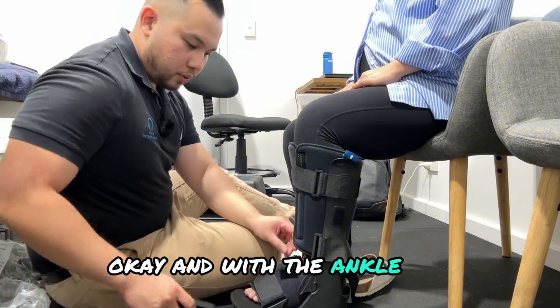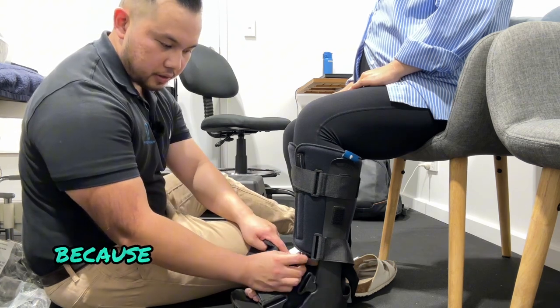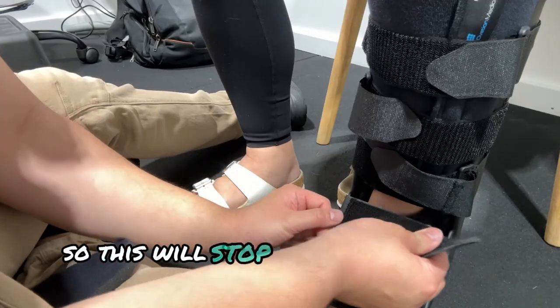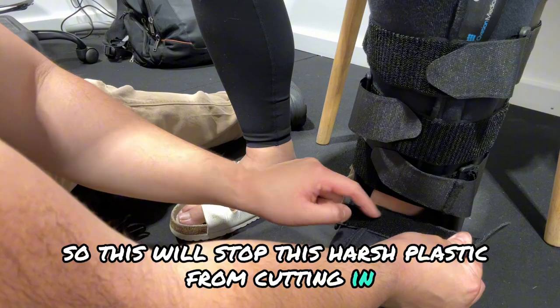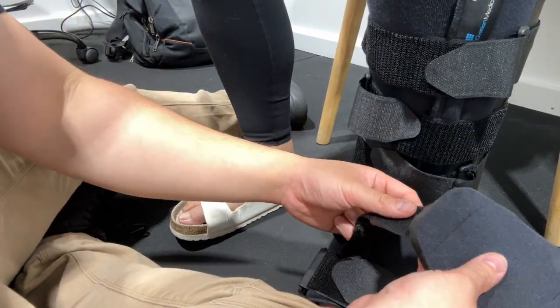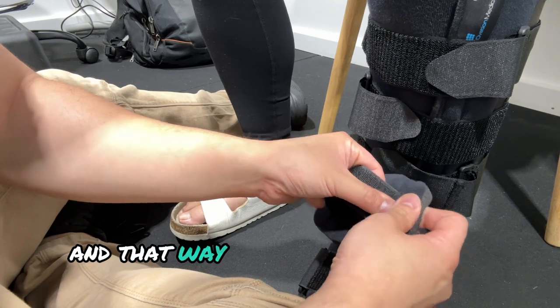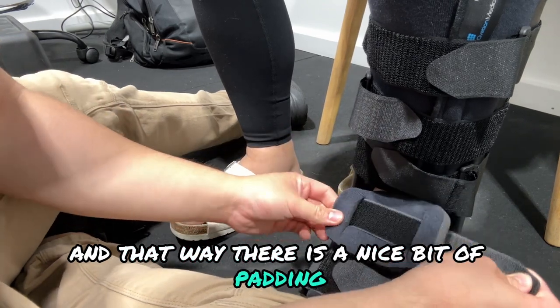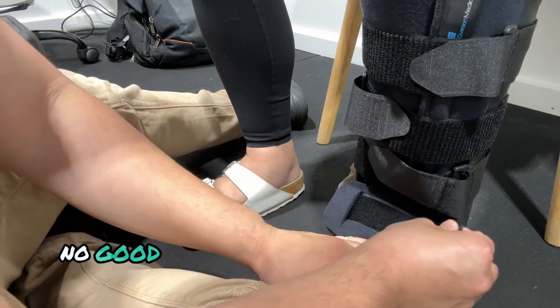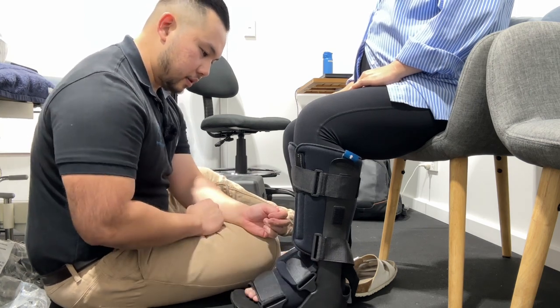With the ankle section, this is where the padding comes in. A lot of people do get friction injuries because the padding here cuts into their skin. So that's where this padding comes in — it will stop this harsh plastic from cutting in. Just make sure to open it up and you can loop it through, just like this, so there is a nice bit of padding between this plastic and the ankle.